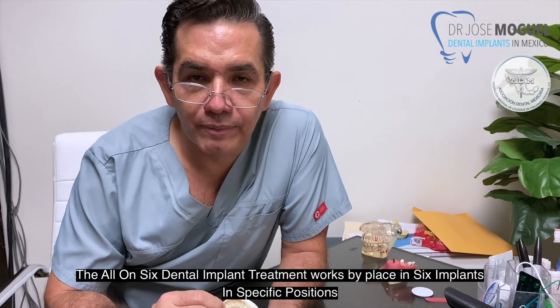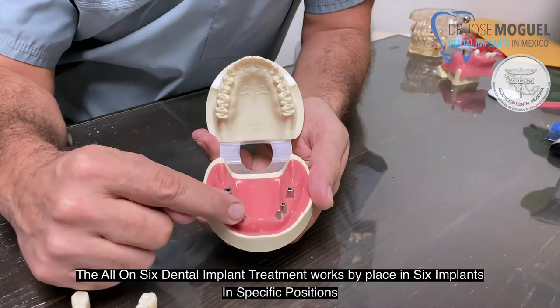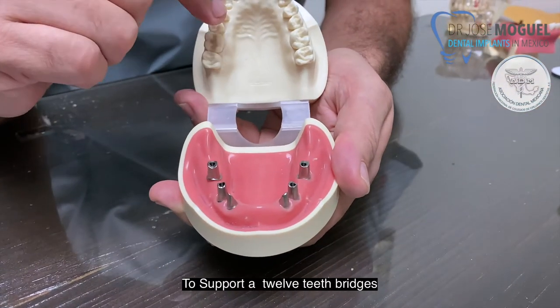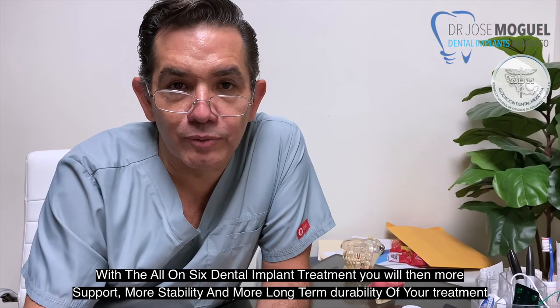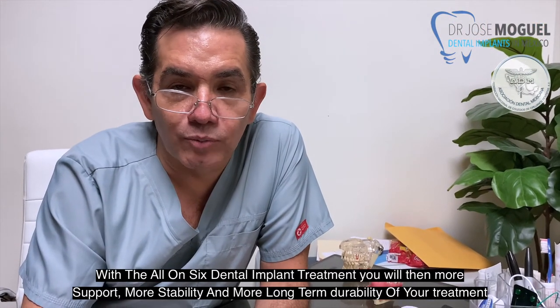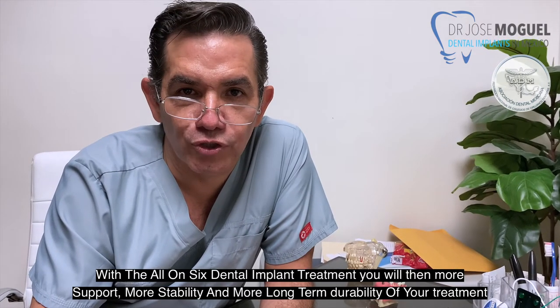The All-On-Six dental implant treatment works by placing six implants in specific positions to support a 12-teeth bridge. With All-On-Six dental treatment, you will obtain more support, more stability, and more long-term durability of your treatment.